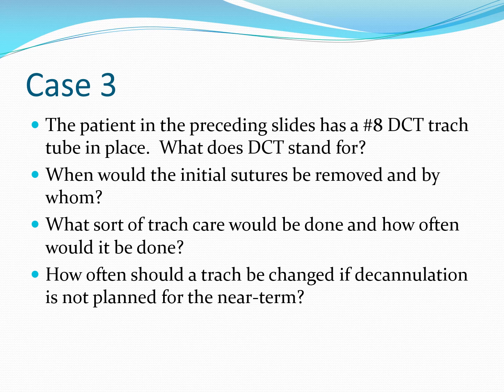Again, it would depend on a lot of variables, but typically no sooner than 2 to 3 days, as long as about 7 days. It's done in collaboration with the physician who's managing the patient. Often it's done in an ICU or step down, and it's a very good idea to get an order, a formal communication from the physician, that it's okay to remove those sutures. They're flange sutures. It can be done by us, it can be done by nursing. Sometimes the physician will want to do it themselves, which is fine.